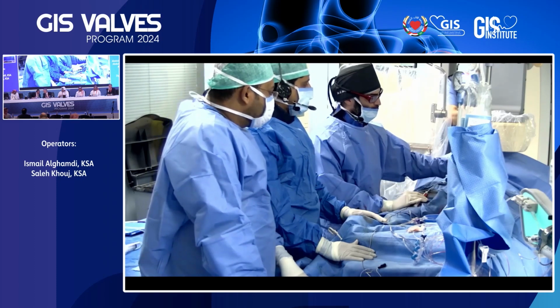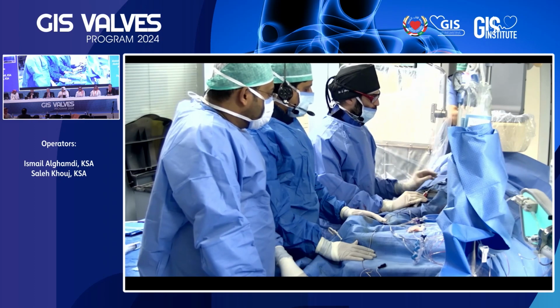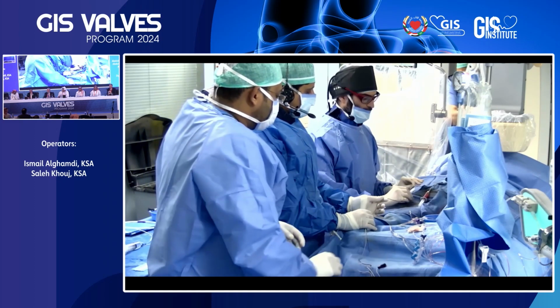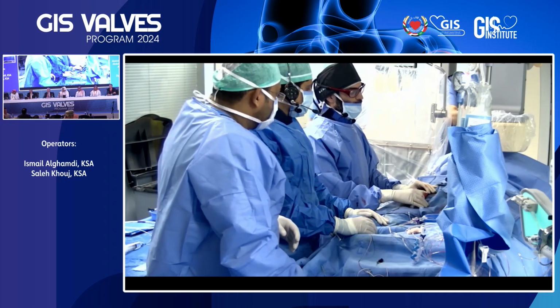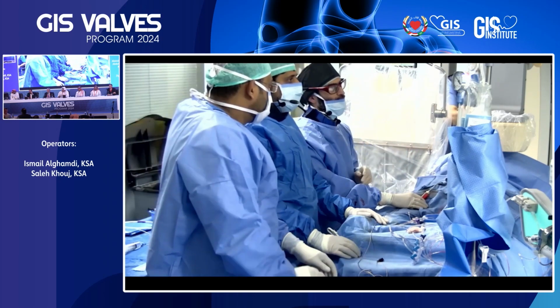So we have a left femoral for the pigtail and right femoral with the 14 French sheath for the delivery system. Also, we go with an LV pacing over the wire of the LV rather than RV pacing. So now we have our three setup shots for the cusp overlap view and the coplanar view.